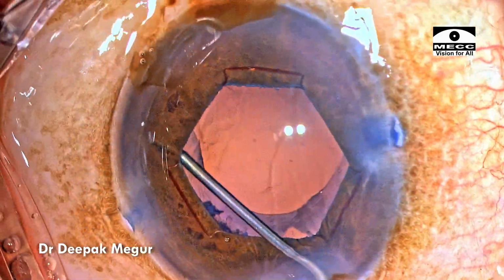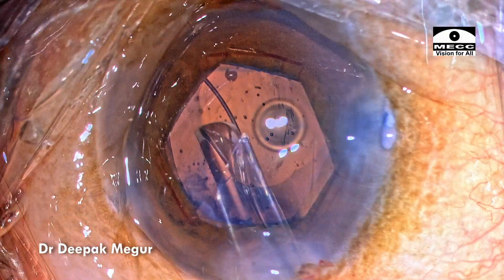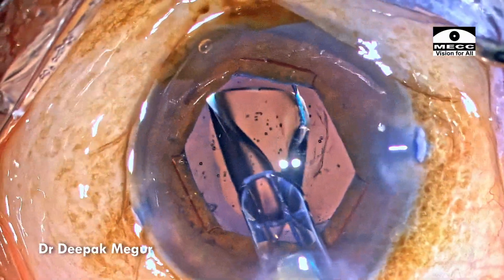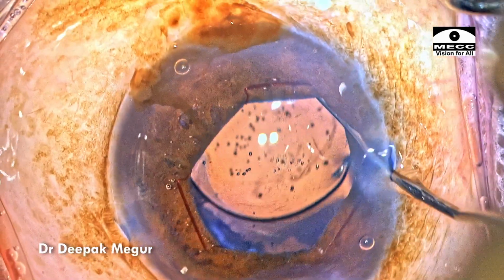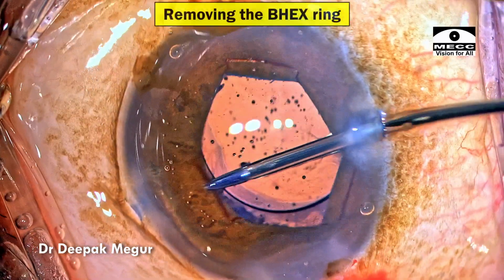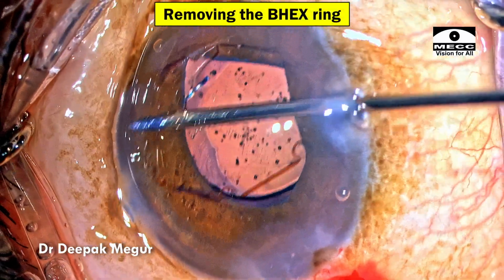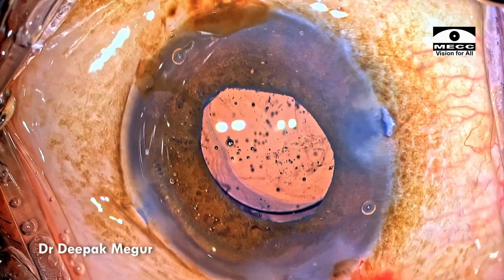Space is created under the iris and above the anterior capsule using cohesive OVD. The distal haptic is gently introduced into this space, and the proximal haptic is then dialed into the sulcus. With the OVD still inside, the BHEX expansion device is disengaged from the pupil and then removed.